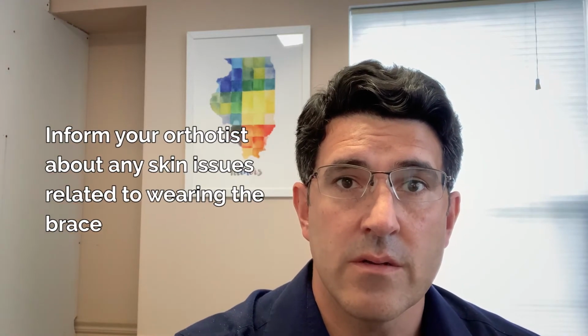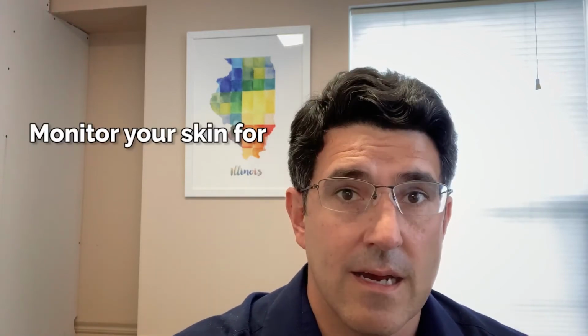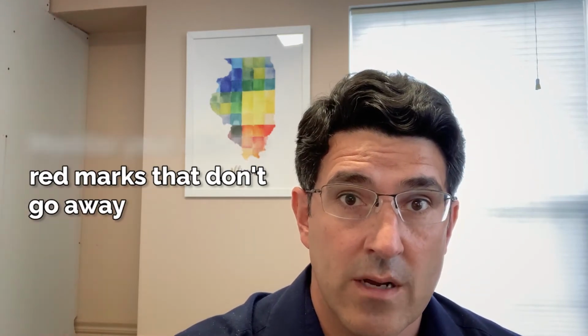Now, I can tell you that sometimes people have issues with their skin and they might see some redness, but the redness goes away very quickly. That's not usually a problem. The problem is when you have a moderate to severe issue with redness that doesn't go away. Now, that's a real issue. Sometimes it might be from rubbing from a loose shoe, or maybe a strap is old, and you need to consider getting new straps around the ankle or foot area, or the shoe tightness like we've talked about.